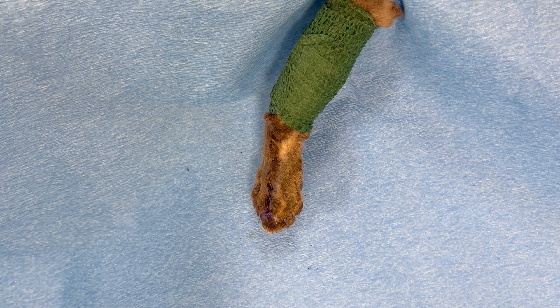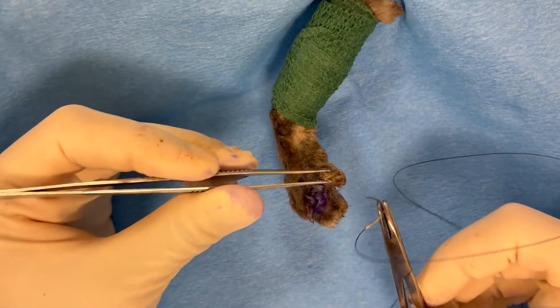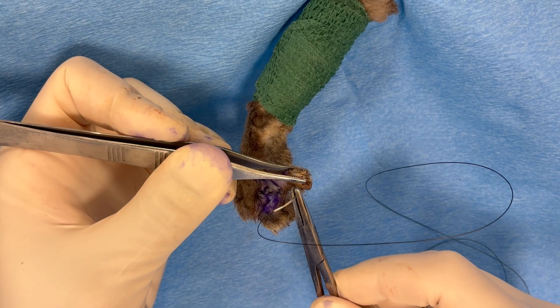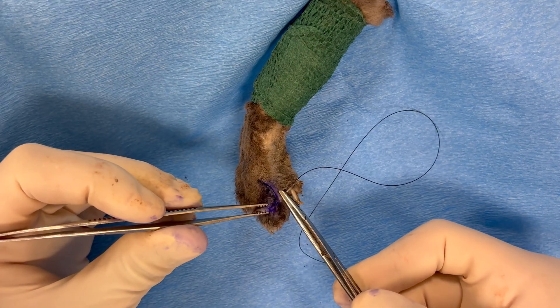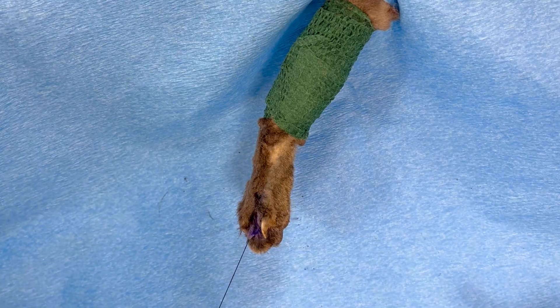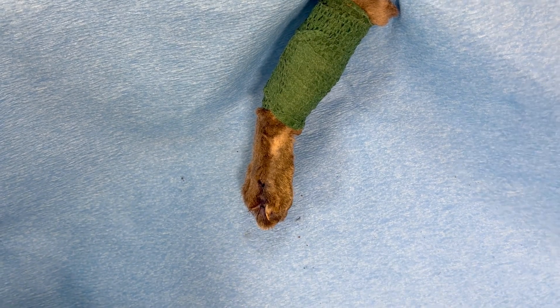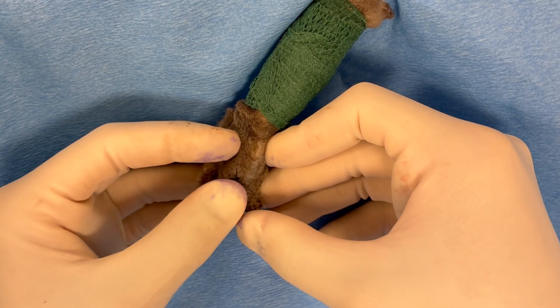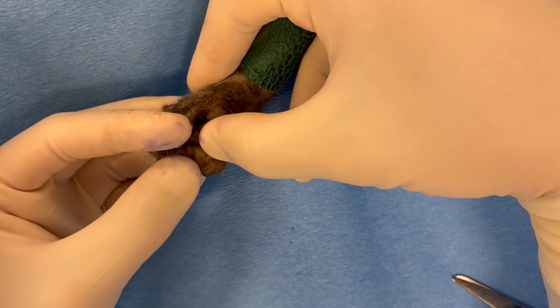Now we are going to the very most distal aspect of the interdigital webbing and suturing the webbing from digit 5 to digit 3. Once this has been applied, you can see how those two digits will come in even further closer in position, which is nice for cosmesis. Now the dorsal sutures are applied in an interrupted fashion. Make sure the skin is well opposed with no tension, and then this limb will subsequently need to be wrapped.